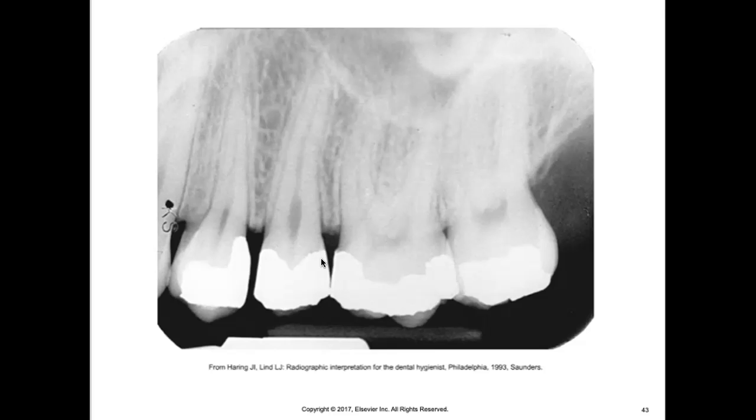For the most part, the dentist did a pretty good job of making sure that these restorations are nice and smooth. The smoother the restoration, the less surface area that bacteria has a chance to grab onto. So this patient can very easily floss, and none of these restorations are going to cause floss to shred. And so when floss doesn't shred or get cut up, patients are more likely to get floss in and out of there more easily. And so for this reason, they have actually some pretty healthy periodontum there.